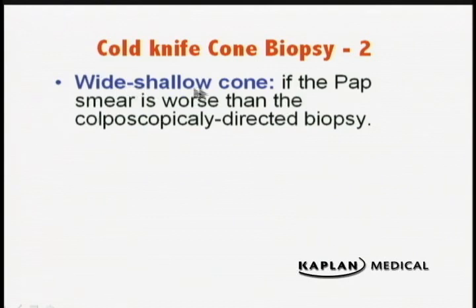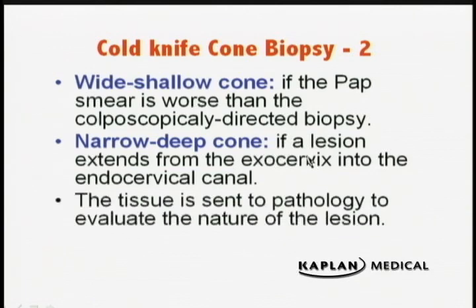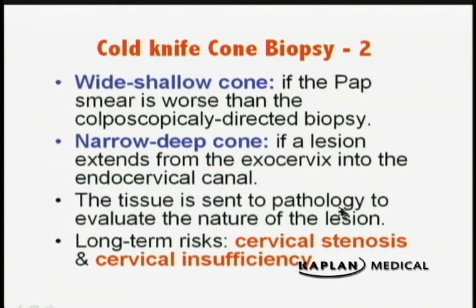We can either do a wide, shallow cone, and you'll see this is done if the pap smear is worse than the colposcopically directed biopsy. If you don't know where the lesion came from, you basically excise the entire exocervix. Or you can do a narrow, deep cone if a lesion extends from the exocervix into the endocervical canal, and we send this then to the pathologist.